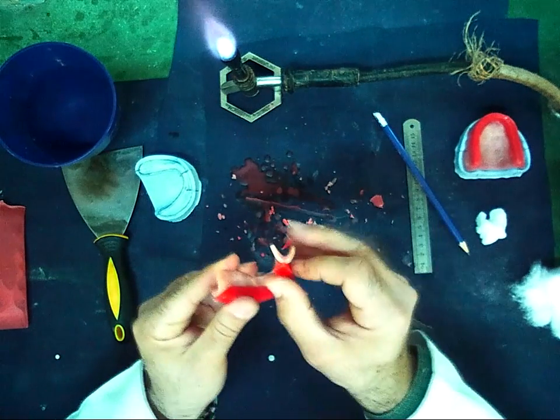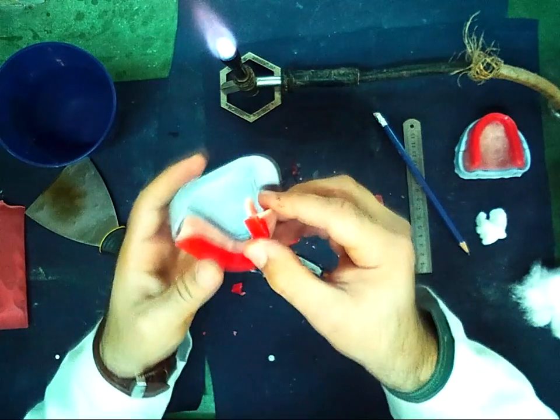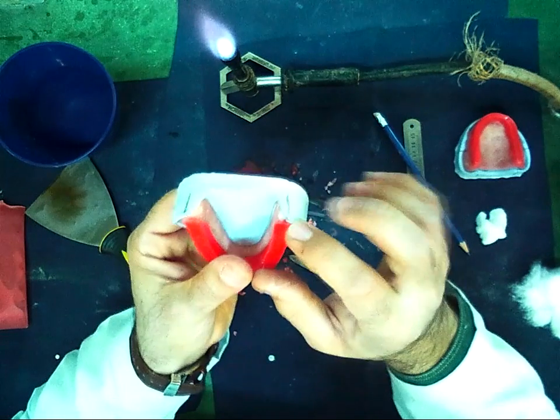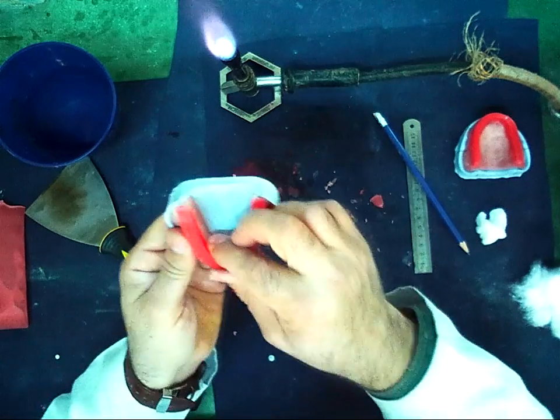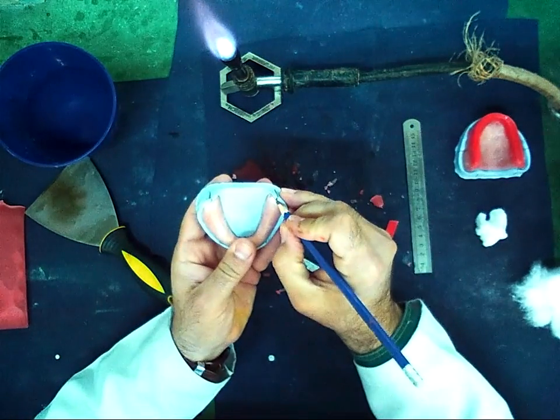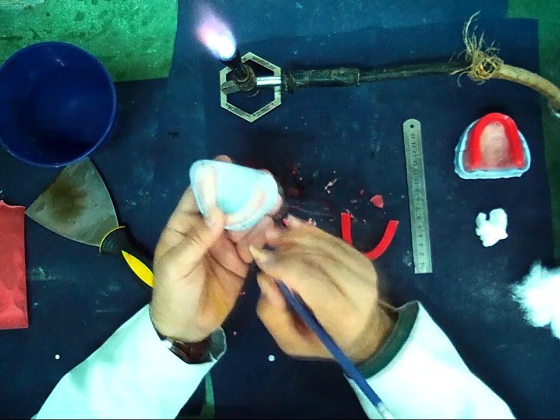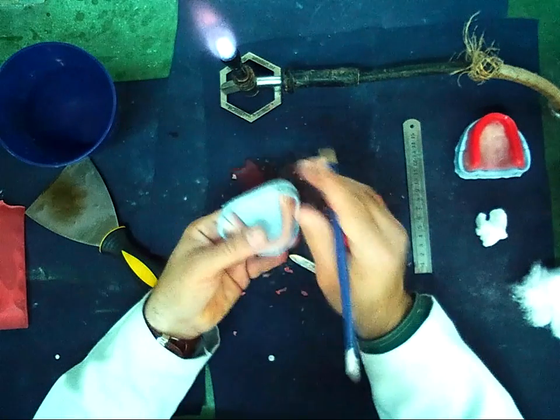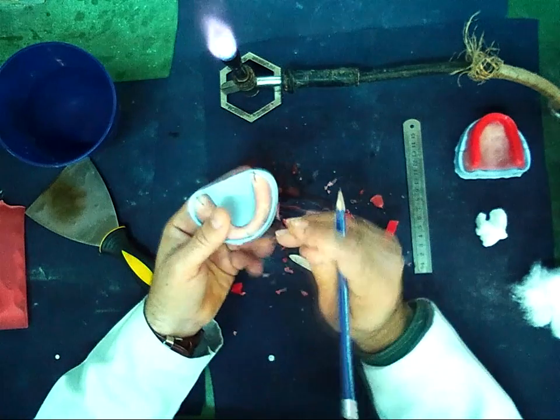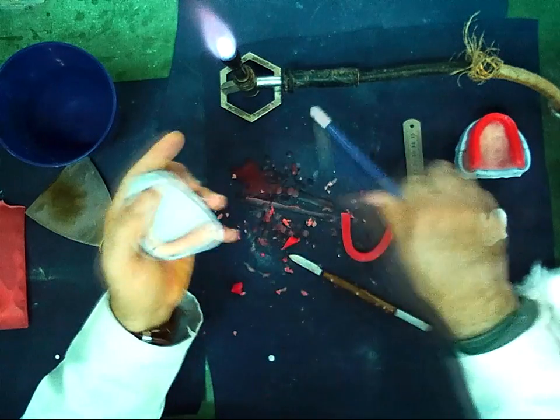Again, I should make my wax on the middle of the crest of the alveolar ridge. The wax should be on the middle of these two lines. So I should transfer this line to the record base. This line, and the canine, and the midline. This line assists us to make the bite rim in the correct place.